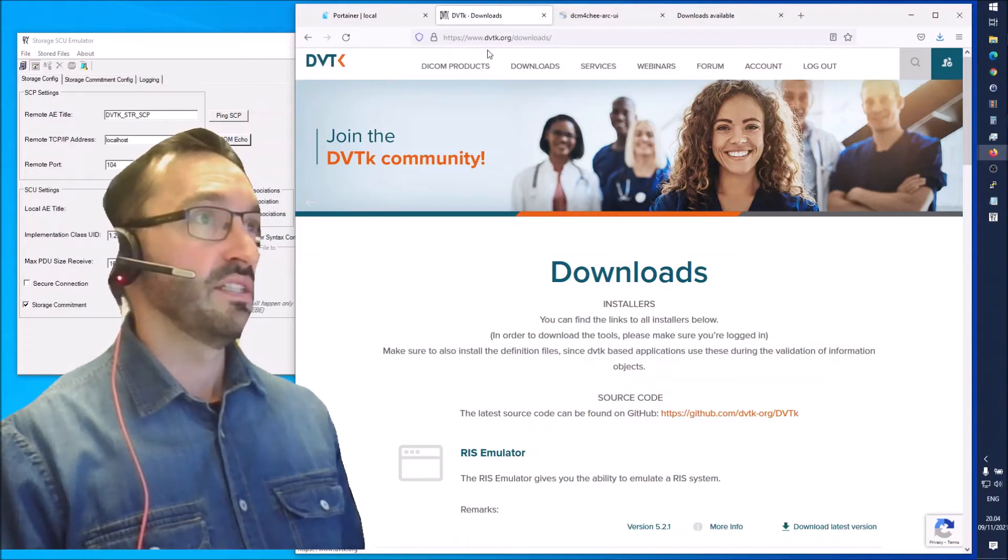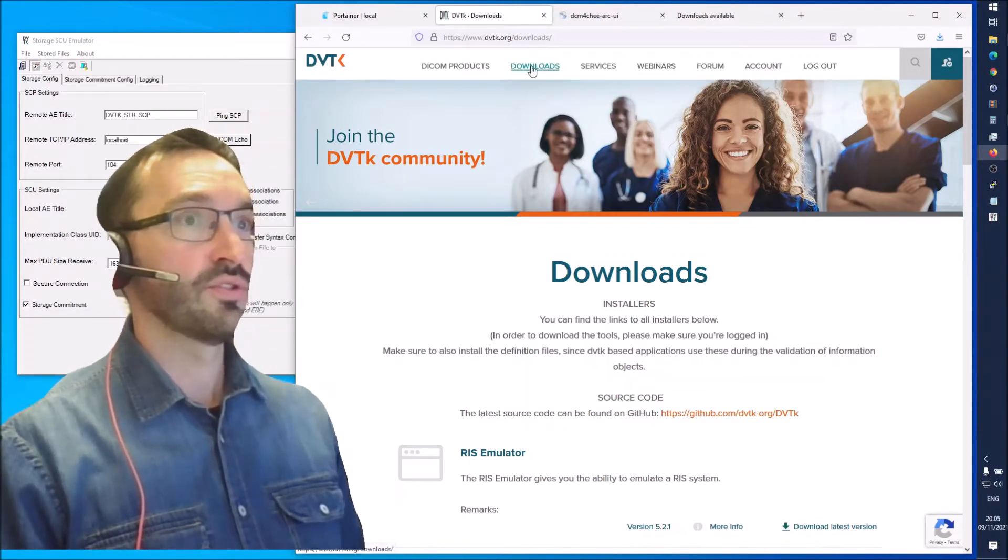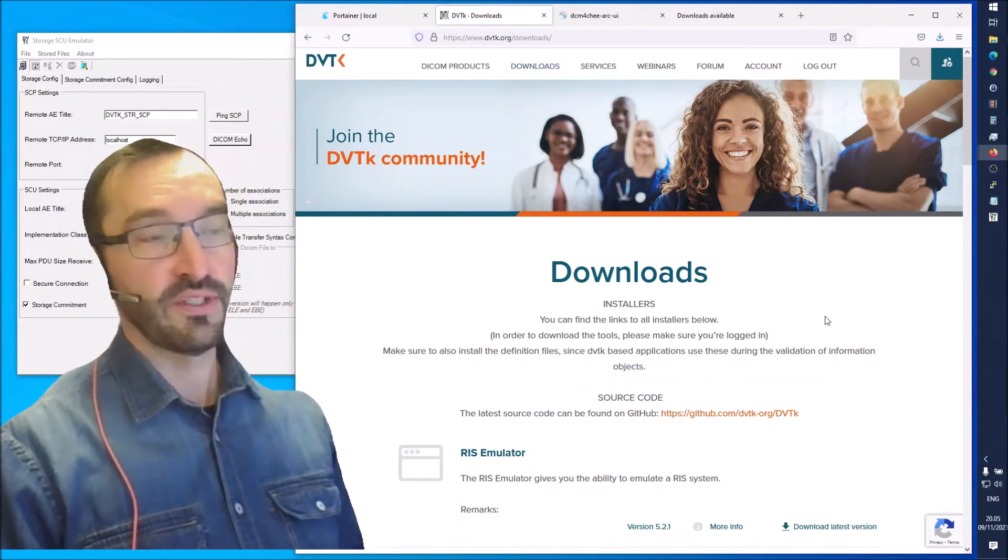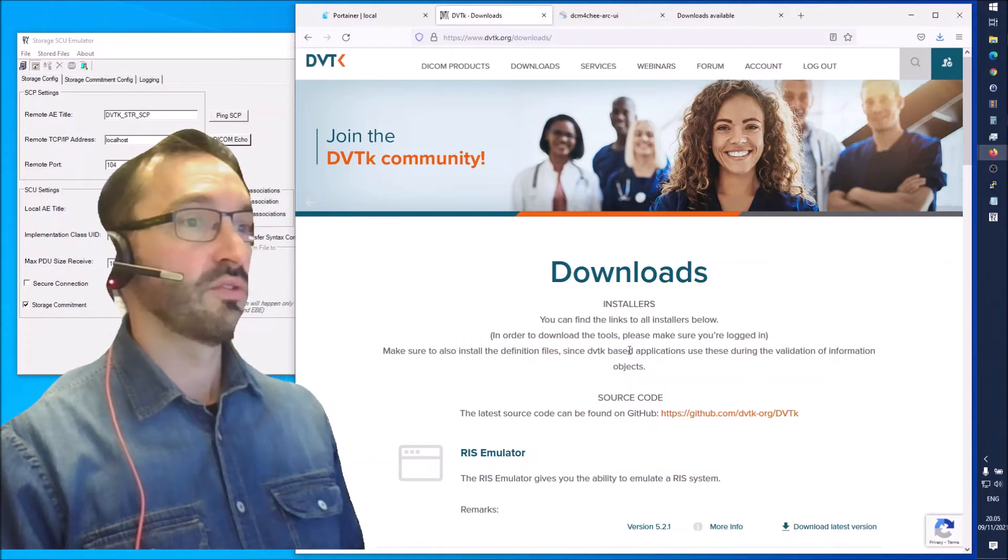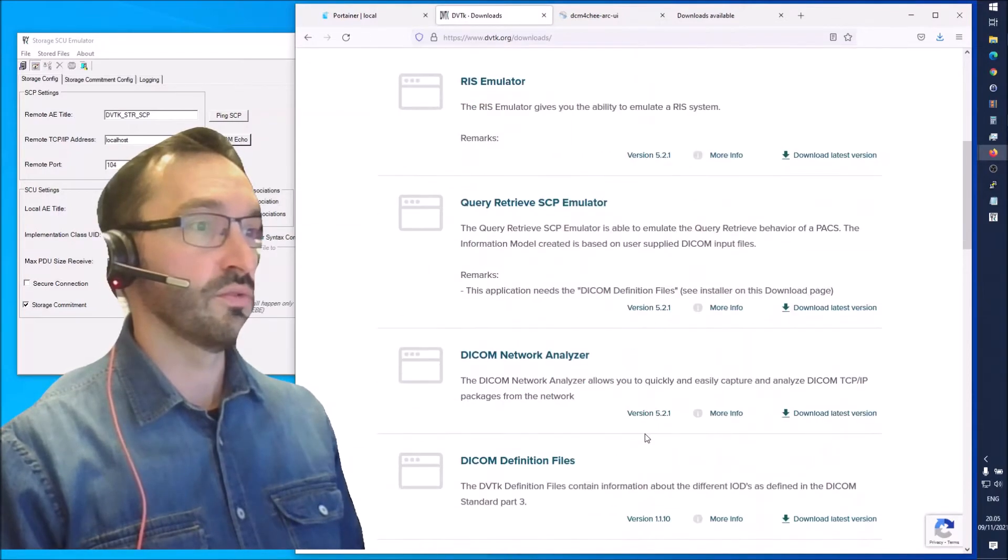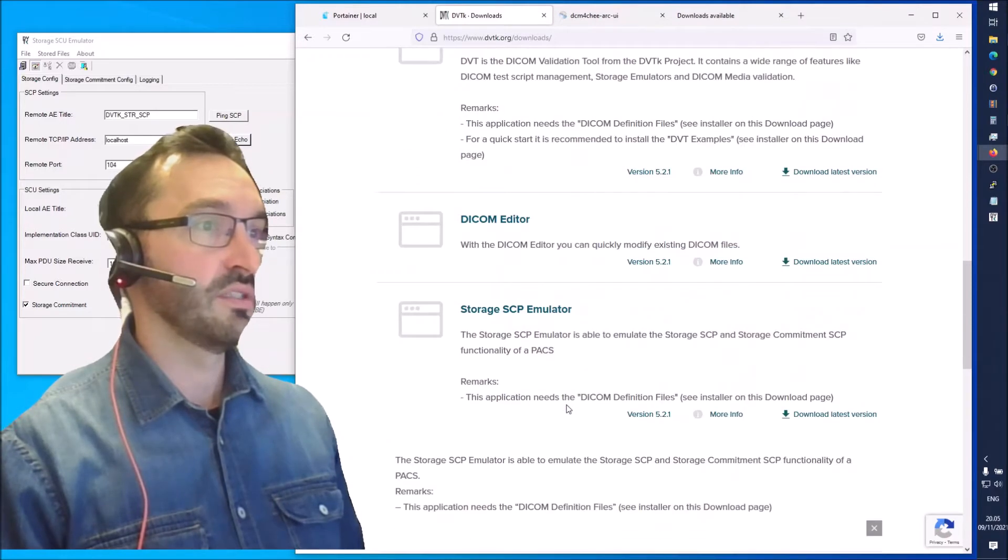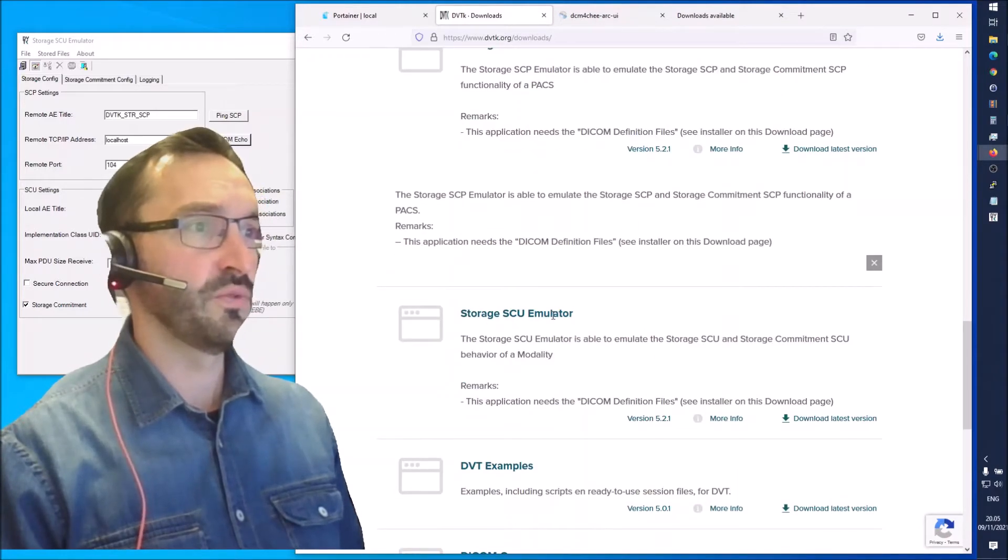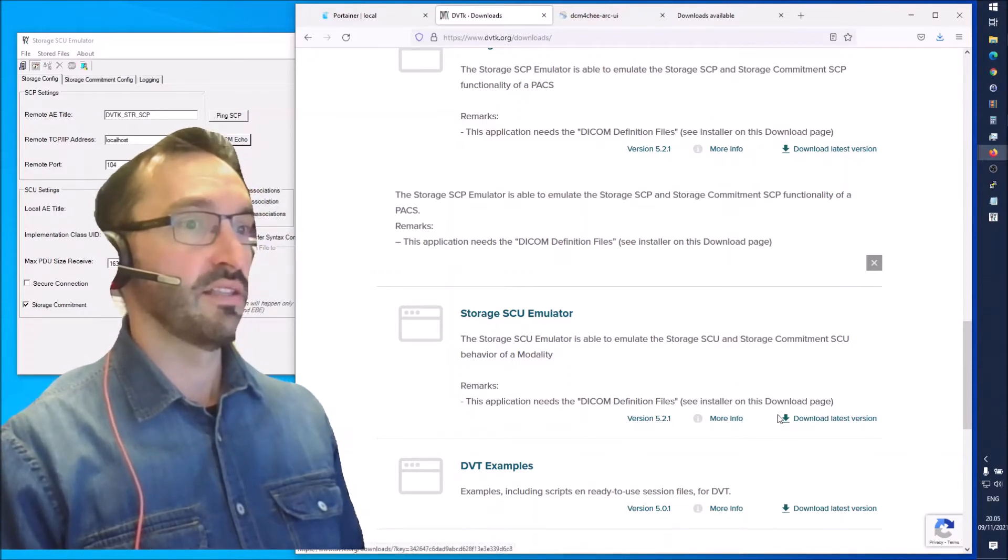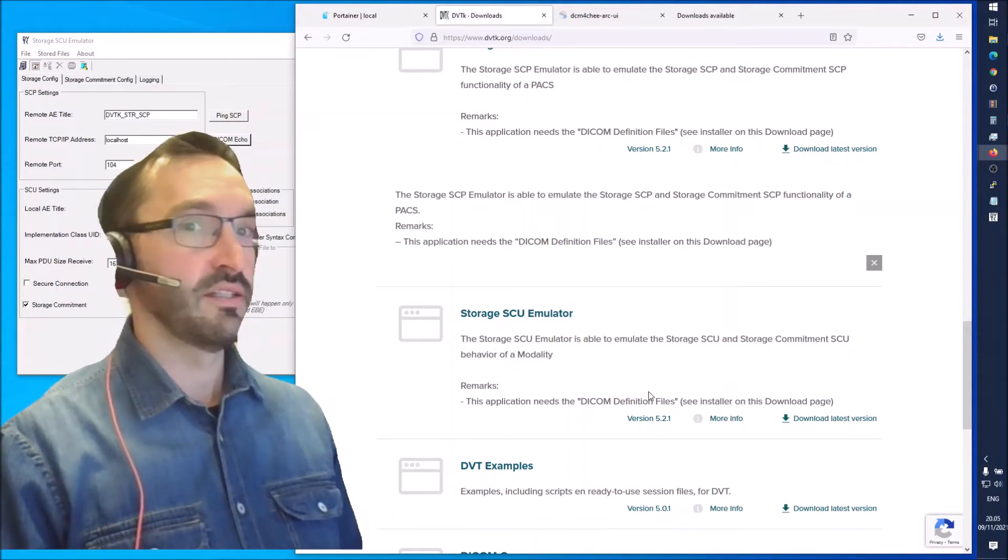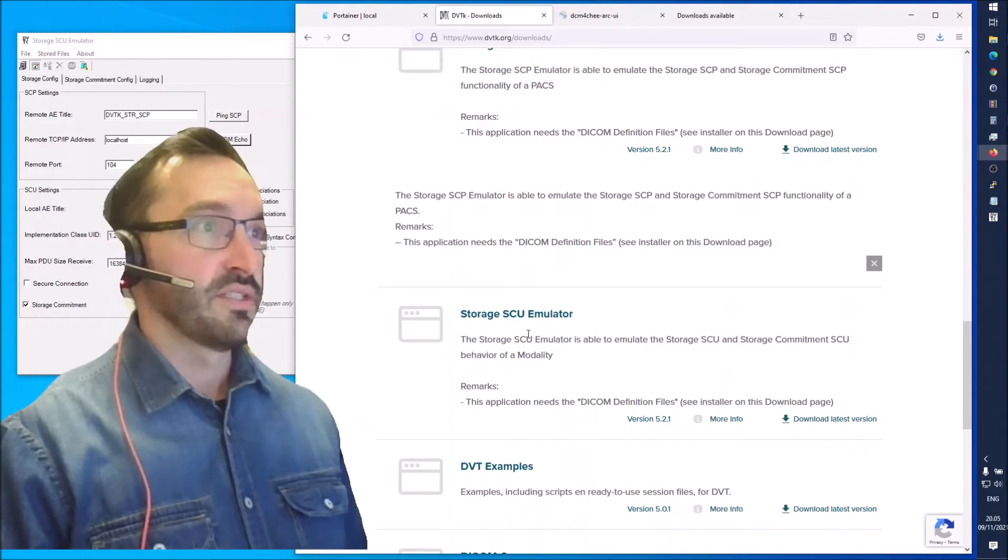You can go to DVTK.org and go to downloads. You need to create a login. It's free, and after you have created the login you can download these tools. There are multiple tools here but today we'll use the storage SCU emulator.